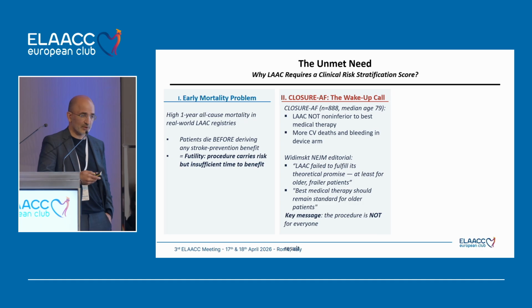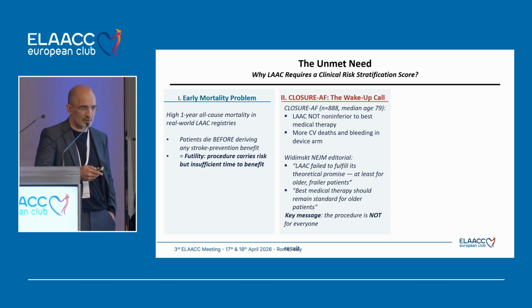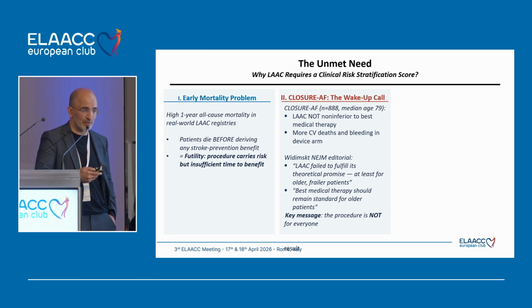So CLOSURE-AF was a kind of wake-up call. We have seen this trial today, which was nicely shown by Karsten. LAAC was not non-inferior to best medical therapy. There were more cardiovascular death and bleeding in the device arm, and you all know these sentences from the editorial: LAAC failed to fulfill its promises, at least for older, frail patients. Best medical therapy should remain standard for older patients. The key message from the editorial was that the procedure is not for everyone.